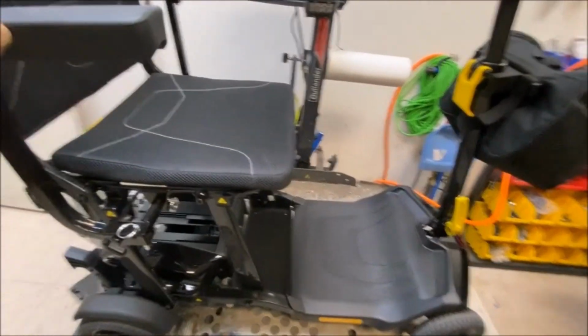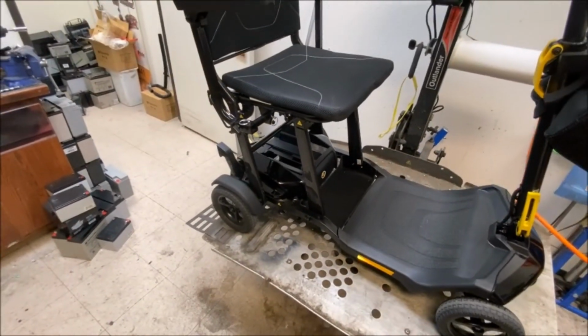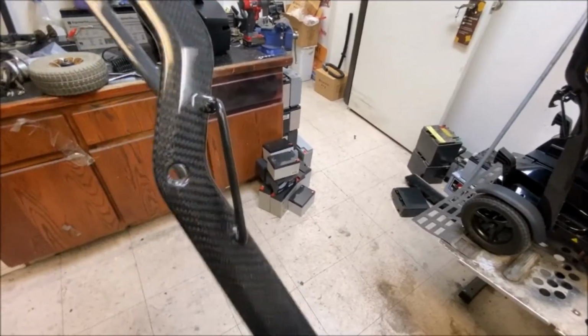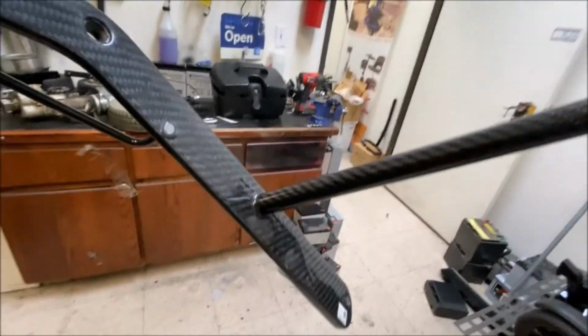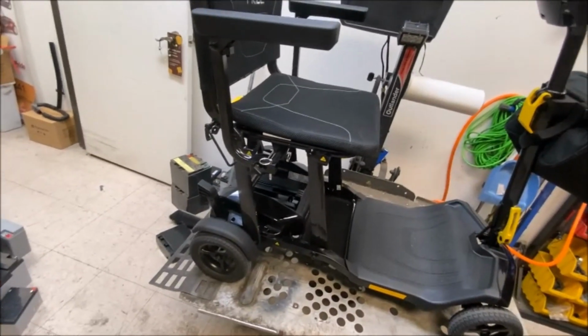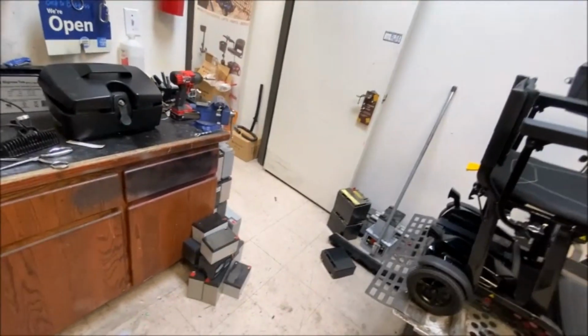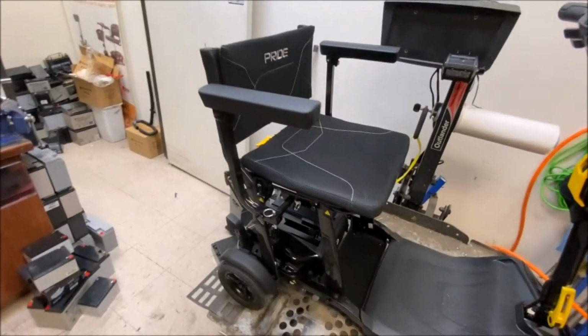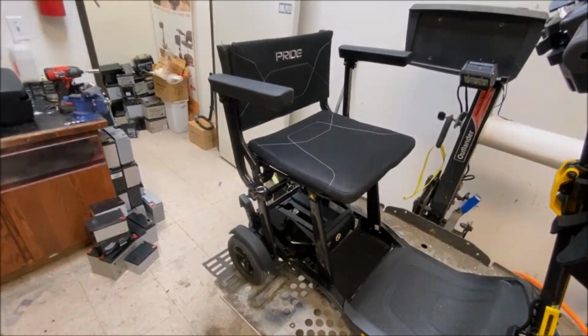And so we'll get into changing that part of the seat frame out. I ordered the part, it came in today. Super lightweight, weighs absolutely nothing. But yeah, it's this part there that broke, there and there. But I'll get into stripping this back piece off. I'll take the armrests off, and just thought I'd show you how it's done. So let's get into it.